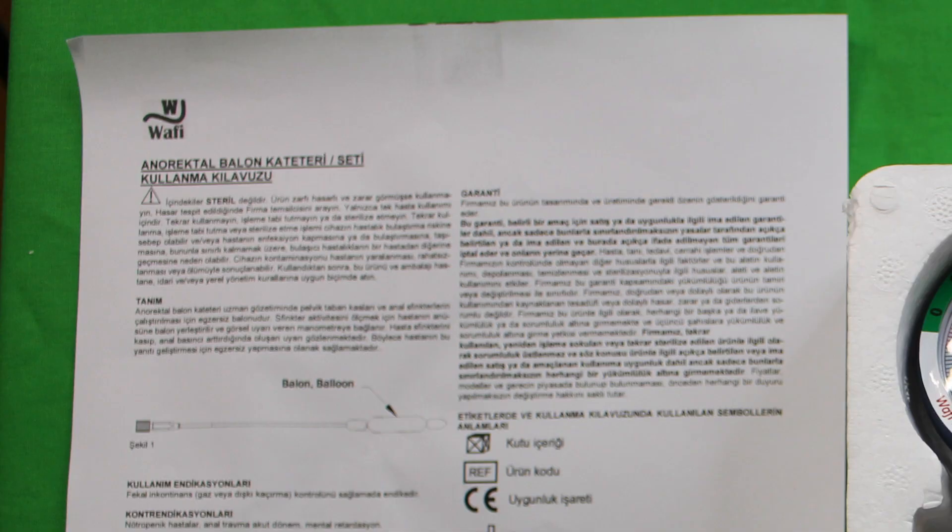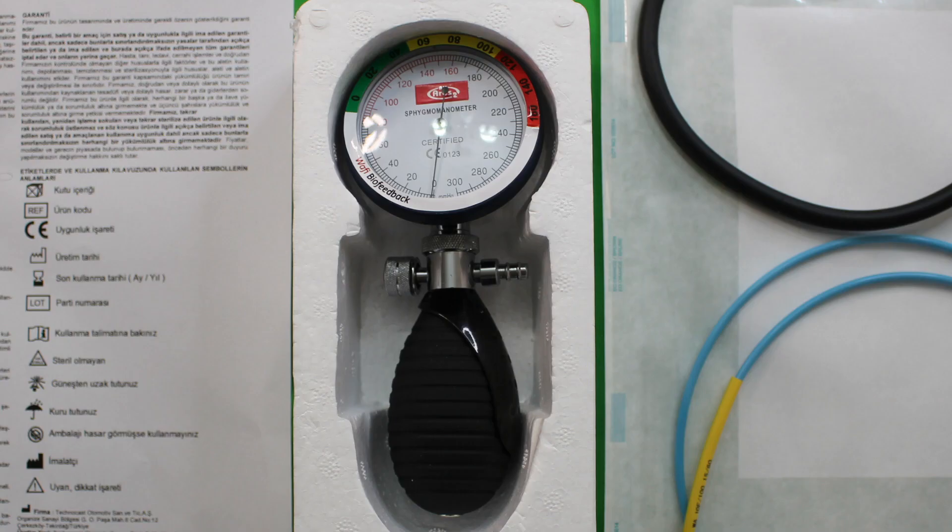When you open the device's box, you will find a user guide, manometer, pressure valve, and balloon catheter.